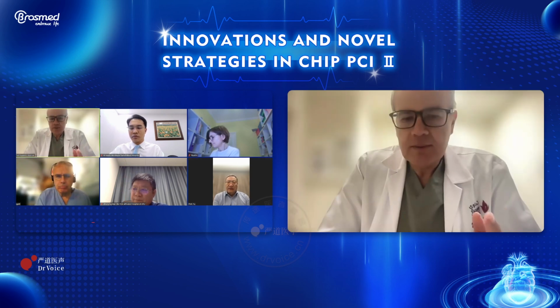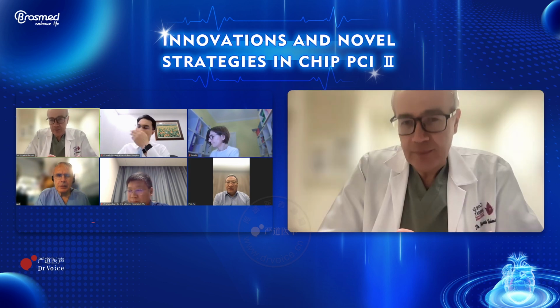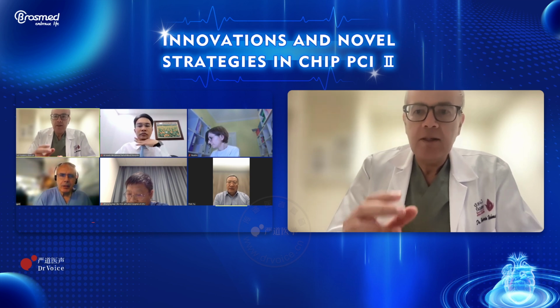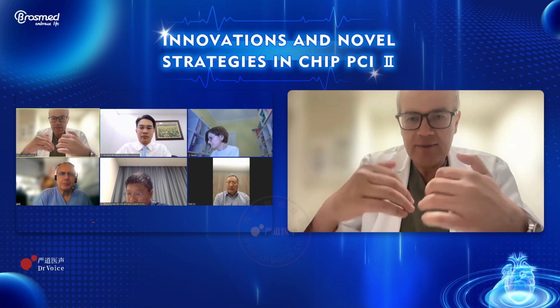Well, it depends on the distal flow. It depends on the presence of residual thrombus, and it depends on the residual narrowing. So when it comes to handling the atheroma in acute coronary syndrome, the atheroma that has ruptured, let's forget about the thrombus and focus on the atheroma itself that has an ulcer.